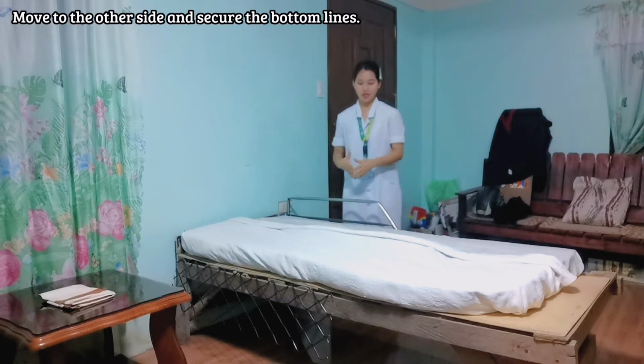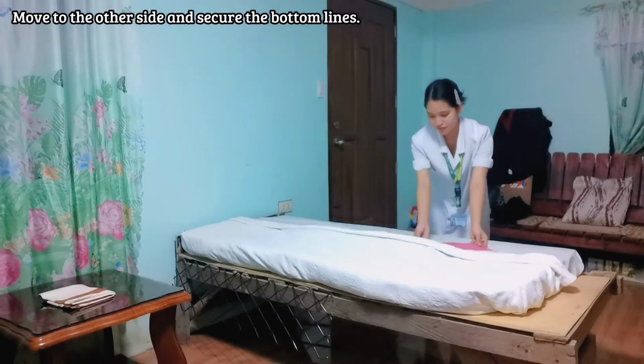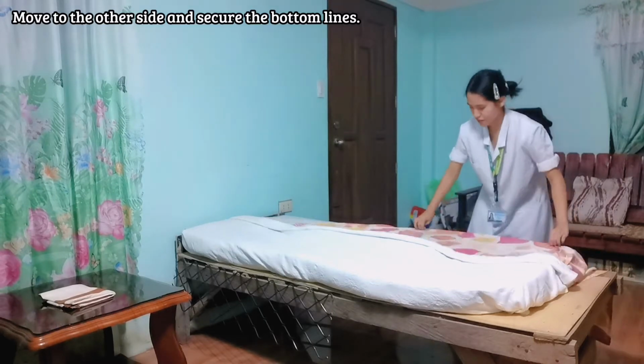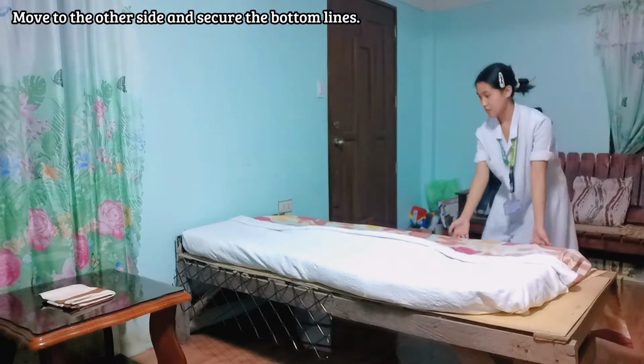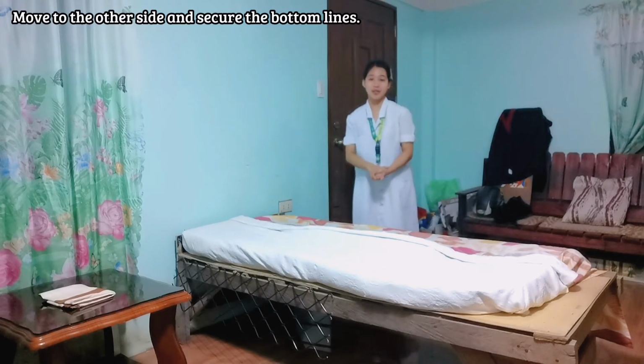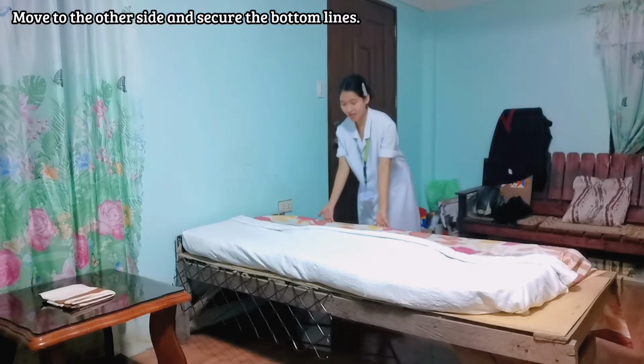And we are going to fix this side by pulling the bottom sheet first. And then the same as we did on the other side, we are going to do it also on this side.